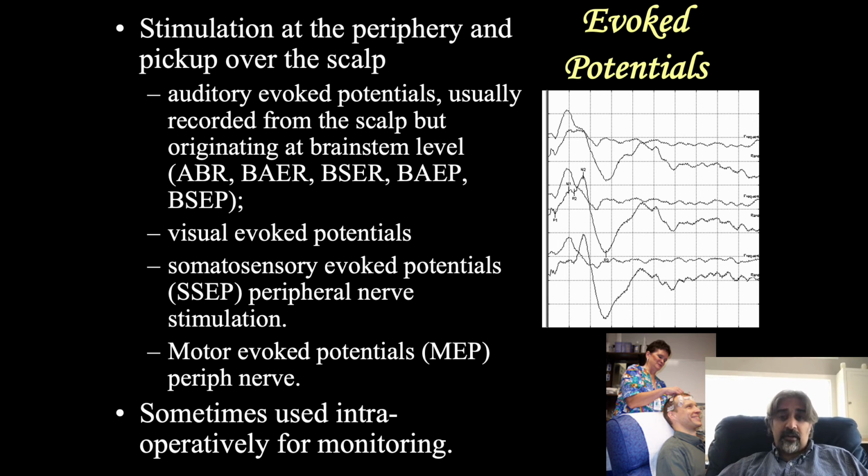Evoked potentials are another type of nerve conduction studies. Here you're stimulating something in the periphery and picking up proximally over the neck or skull. These can be auditory, visual, motor, somatosensory, etc. So they are used sometimes for intraoperative monitoring during neurosurgery as well.